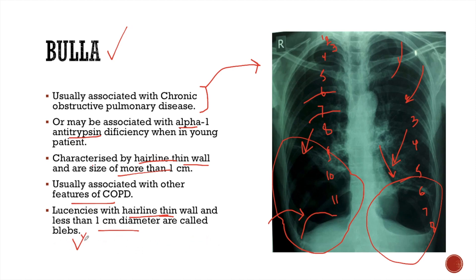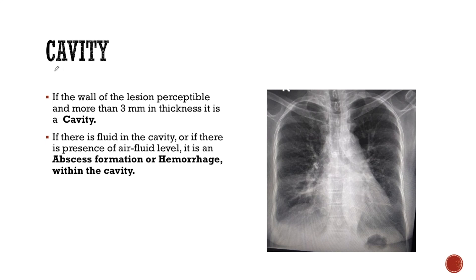Blebs are also associated with chronic obstructive pulmonary disease. Now, coming to cavity: if the wall of the lesion is perceptible and is more than 3 mm in thickness, then it is known as a cavity. In this X-ray, we can see a lucent lesion in the right middle zone which has a perceptible wall, and this wall is more than 3 mm in thickness — so this is a cavity.